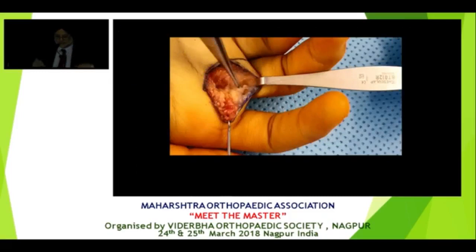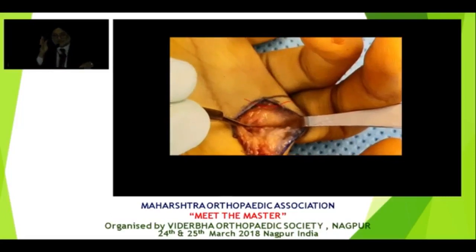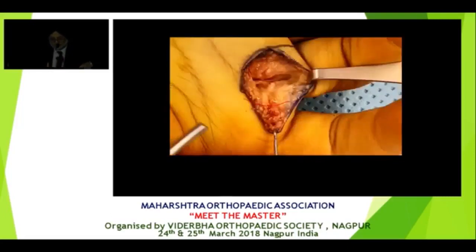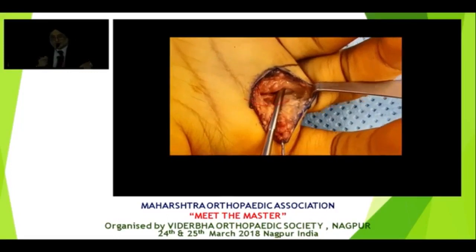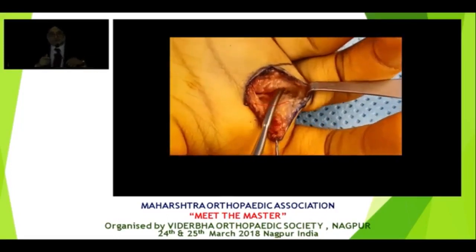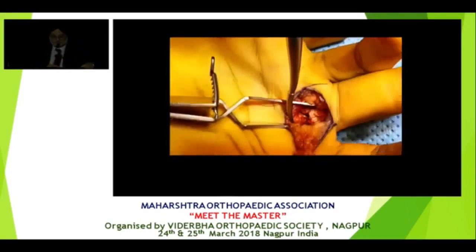So here's a volar approach. That's the flexor tendon sheath. And the neurovascular bundle is right here. So we're cutting on the bone sharply at the side of the flexor tendon sheath. Now you don't want to open the flexor tendons because you don't want them to get scarred down. So you elevate carefully the entire flexor tendon sheath off the bone. Once you've elevated that, now you're looking at your fracture right there.